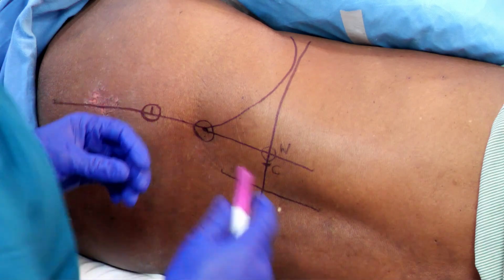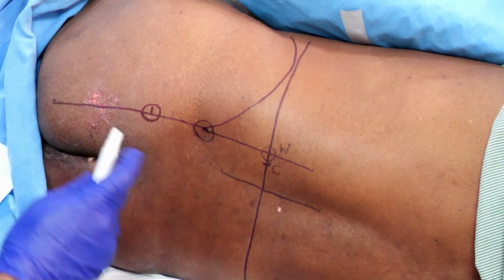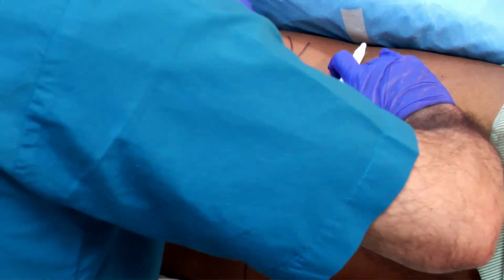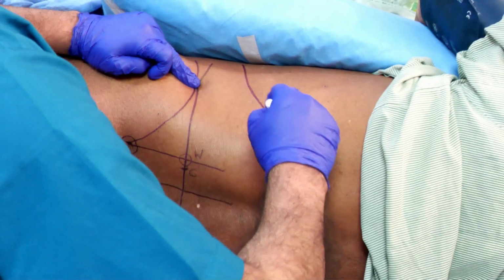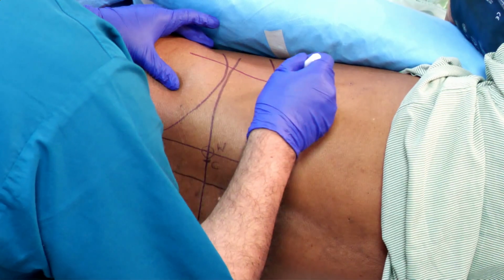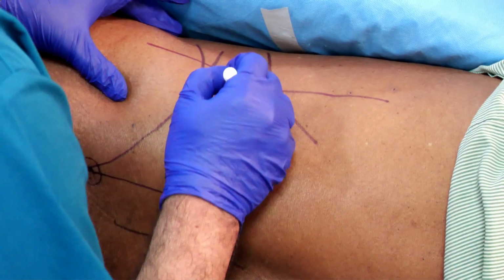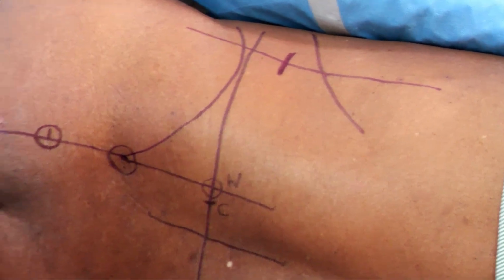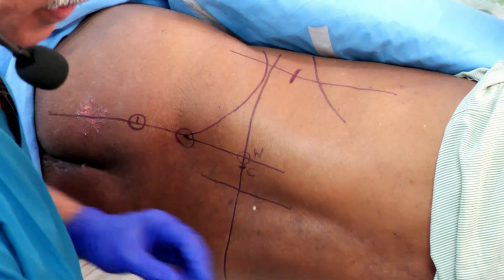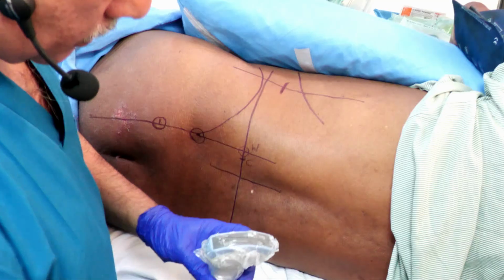Now for the lumbar plexus, the Shamrock technique with ultrasound. So this is the subcostal margin again. This is the iliac crest. In the mid-axillary line, at its midpoint, you need to place the curvilinear probe, and then you have to look at the paravertebral sonoanatomy.